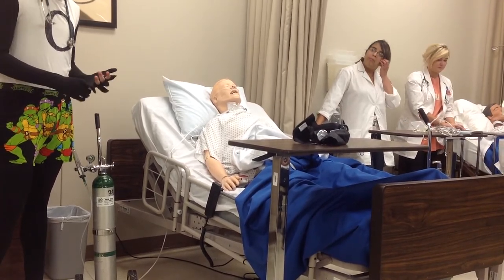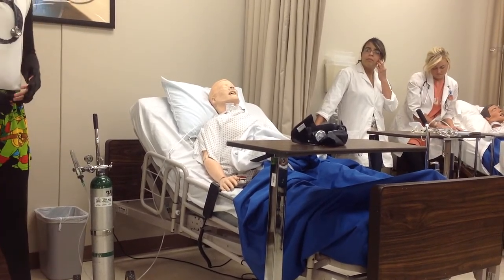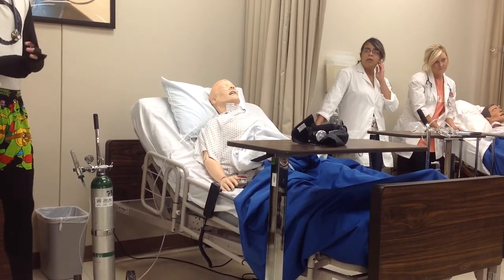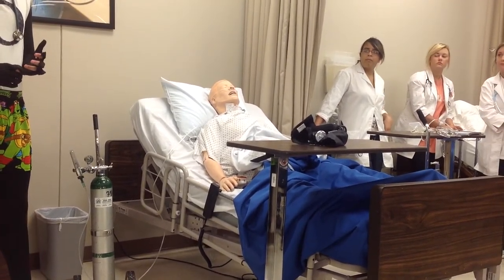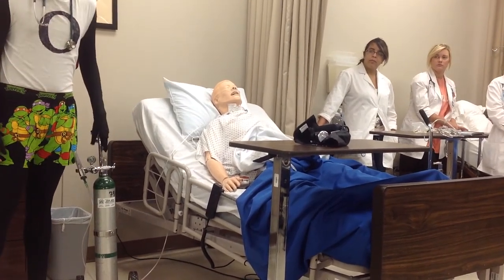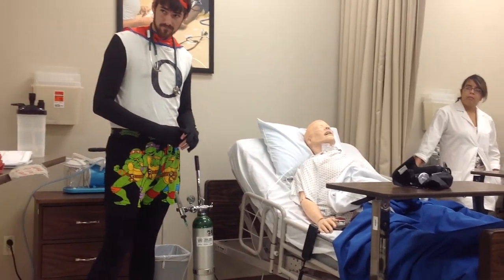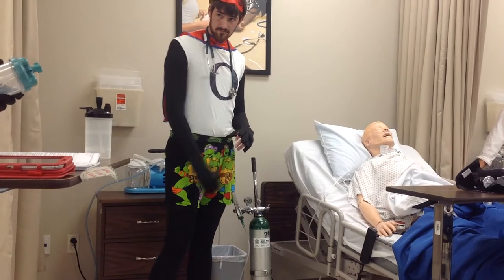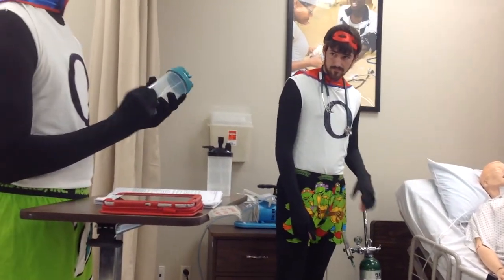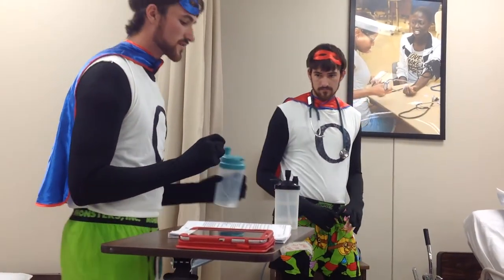And so once you come back every 2 hours, you also want to check every 4 hours. You want to check your doctor's orders to see if the dosage has changed, if he wants to take them off or anything like that. Also, your doctor will specify if they want humidified water or not. What that simply means is that they want moisture in the air that they're receiving. And as far as changing these, they come in a pre-filled pack. They have sterile water in them. You check your policy and procedures to see how and when you change it.